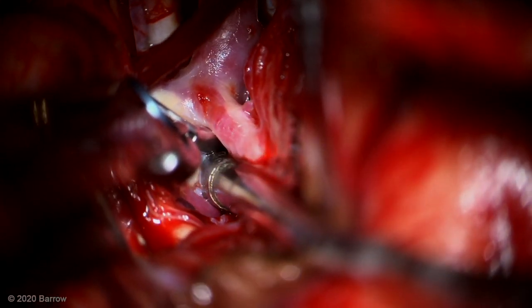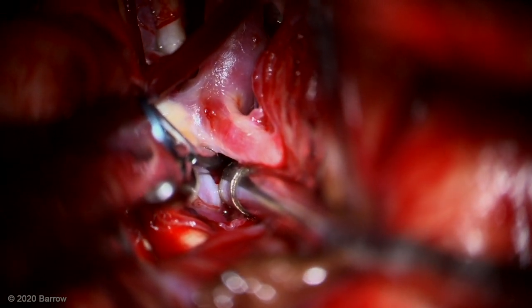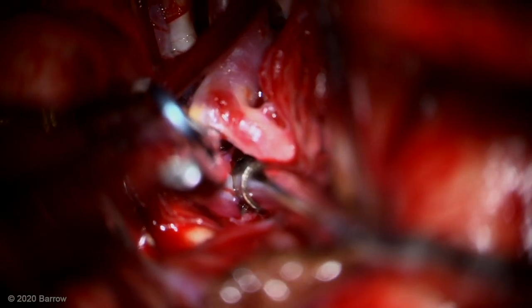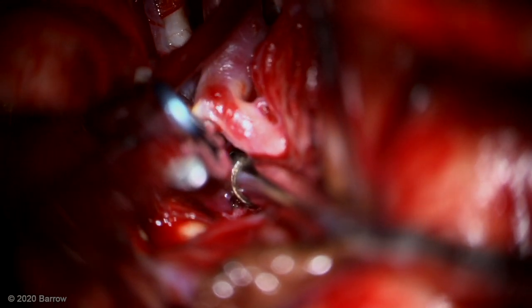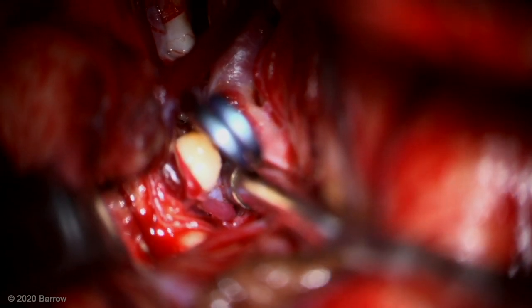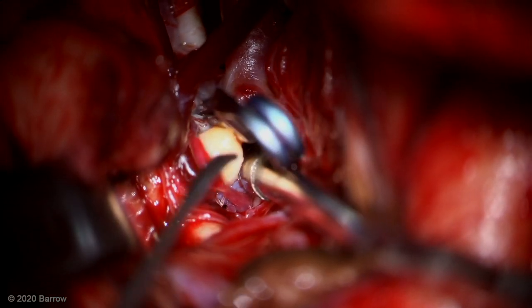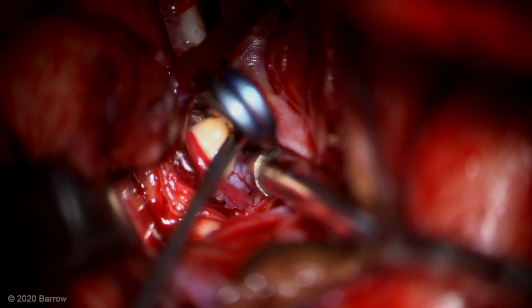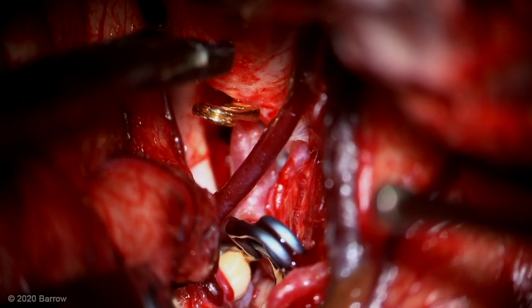Here now I'm going in with a straight Yasargil clip right across the neck. The blades roughly parallel the A1-M1 contour, and I've worked the blades around the perforators on the deep side. You can also see how the recurrent artery of Hubner is well above the blades of the clip.